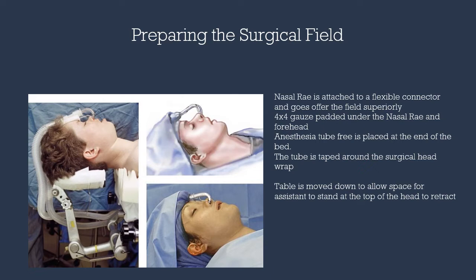Attention is then turned intraorally where a throat pack will be placed. The patient's dentition will be cleaned with a toothbrush and Peridex. Local anesthesia will be applied through various nerve blocks and infiltrations. The scrub nurse is directed to prep the patient with Betadine from the forehead all the way to the clavicles, including the nasal tracheal tube. Once scrubbed in, four surgical towels are placed to isolate the field along with a split drape. The superior surgical towel is stapled around the nasal tracheal tube.